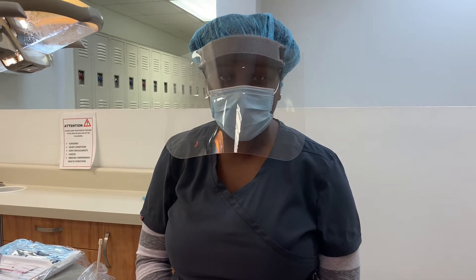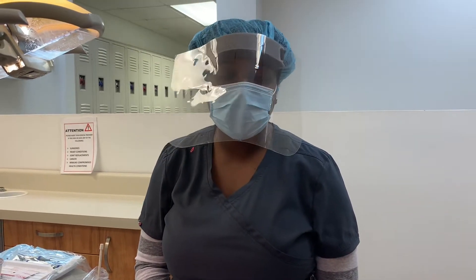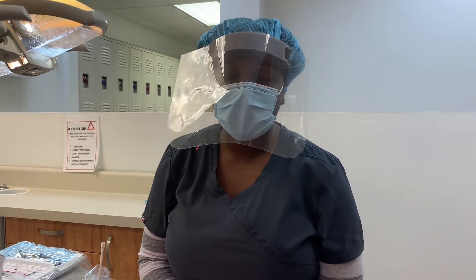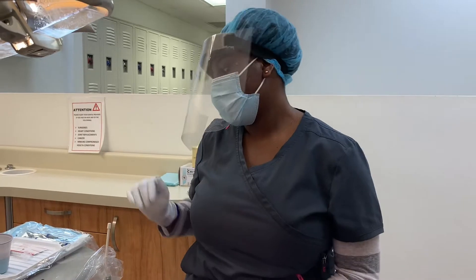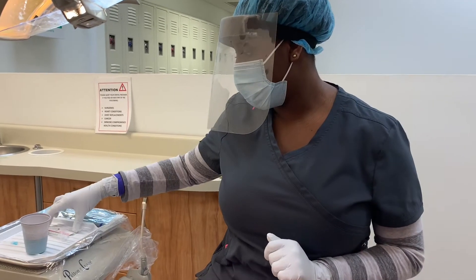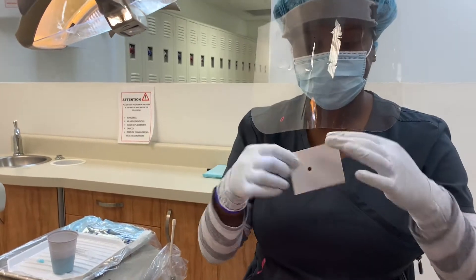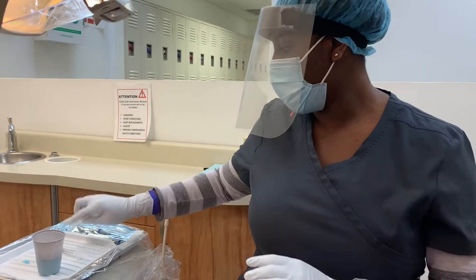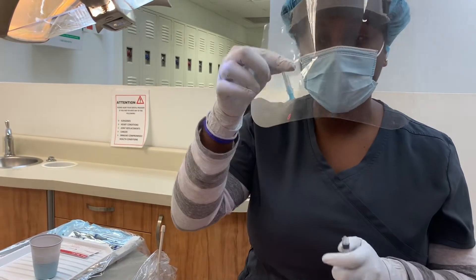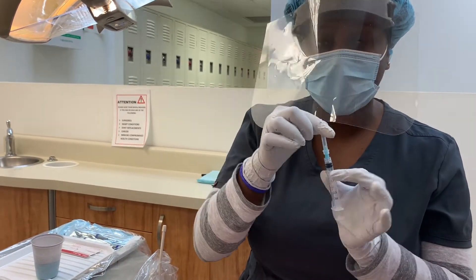Like any clinical procedure, we need specific materials: a paper tray to cover our materials, a tray to keep the materials we need, a protector sheet to help us scoop the cannula cap to the cannula, a syringe to hold the solution, and the cannula that will dispense the solution.